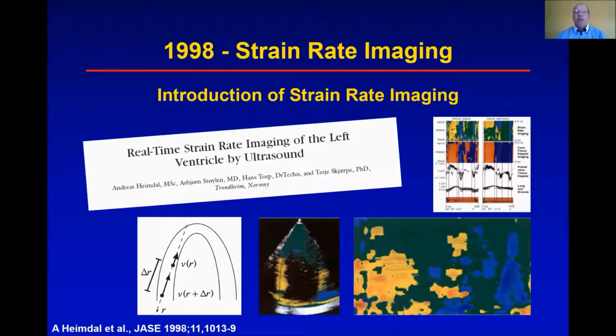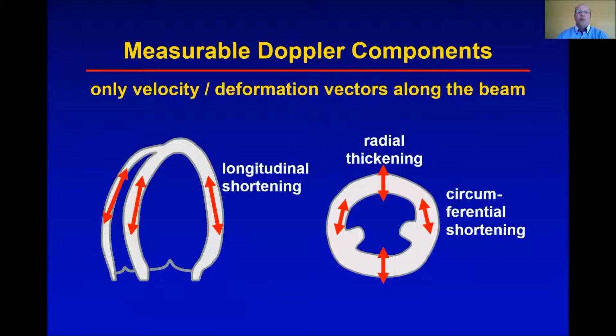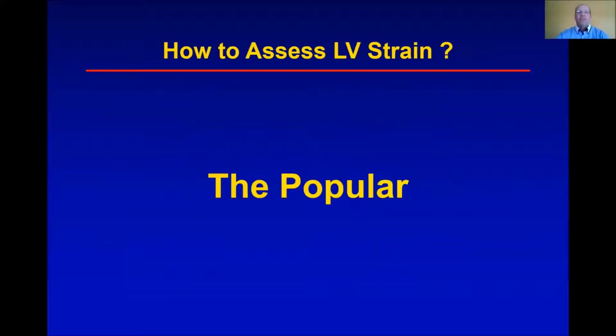This is still today a good method to work with, because it's one of the methods with the highest temporal resolution in non-invasive cardiac imaging. However, it's a bit cumbersome to use, and especially if you want to have a comprehensive assessment of the entire left ventricle, it's not so straightforward. We are also limited to the Doppler direction, so we can only assess the deformation of the myocardium in the direction of the ultrasound beam, and therefore it has some limitations.